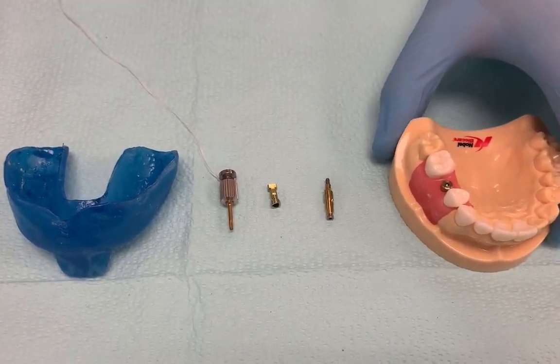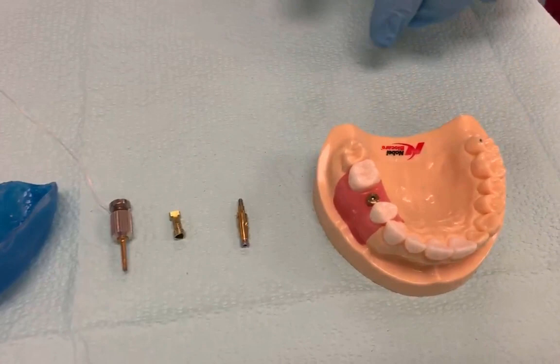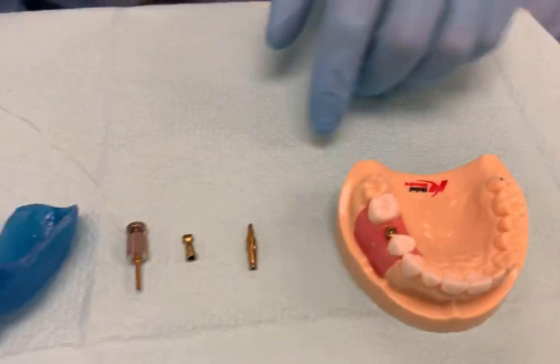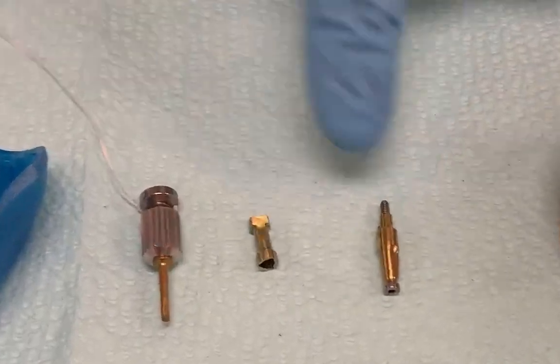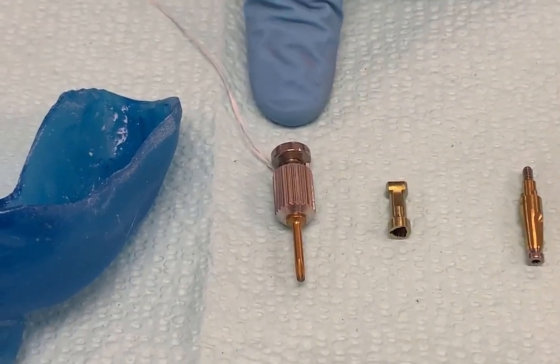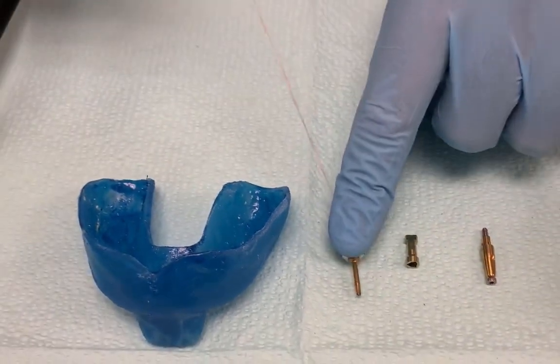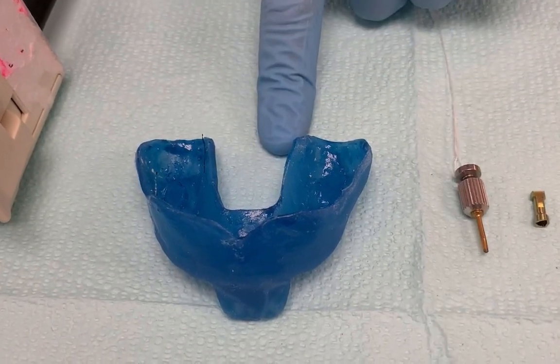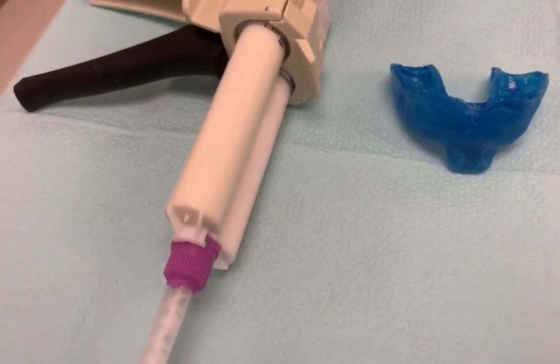What we have here is the simulated patient with the healing abutment. We have the transfer impression coping, the implant analog, and the driver with floss attached to prevent aspiration. And then the custom tray and obviously the impression material.